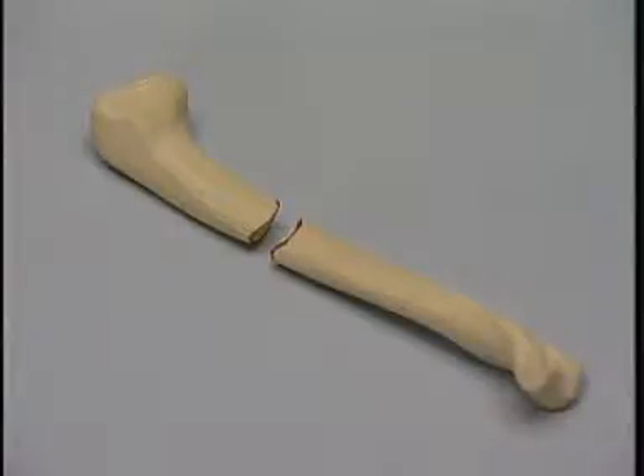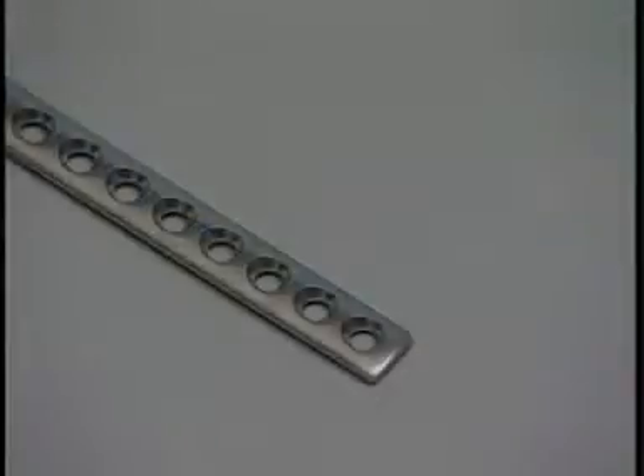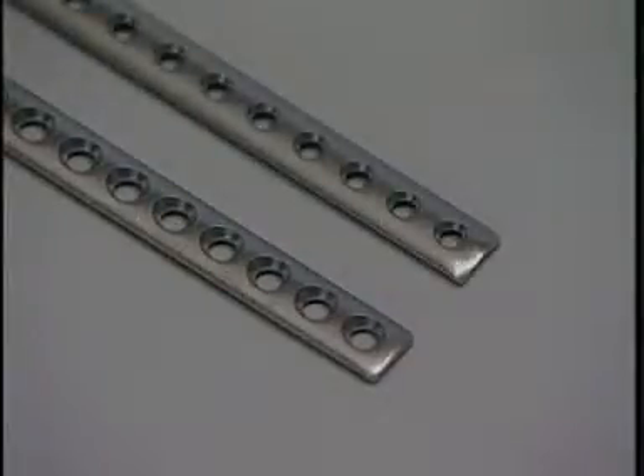The veterinary cuttable plate is very useful in the repair of small bone fractures, such as this transverse fracture of the feline humerus. The cuttable plate comes in two sizes. The plate at the bottom of the screen will accept 2.7 and 2 mm screws, while the plate at the top accepts 2 and 1.5 mm screws.